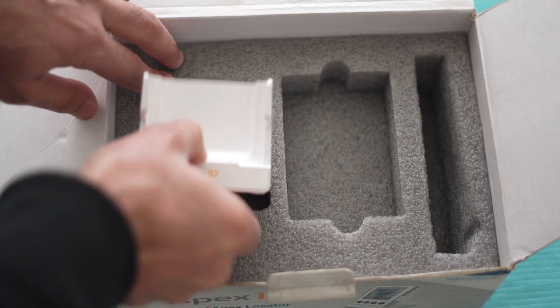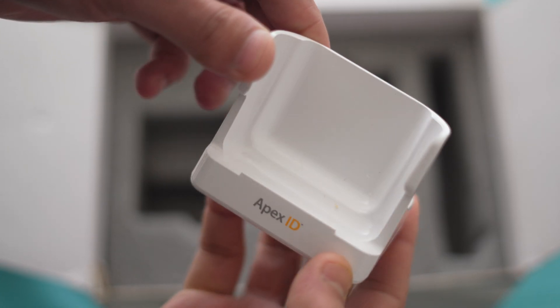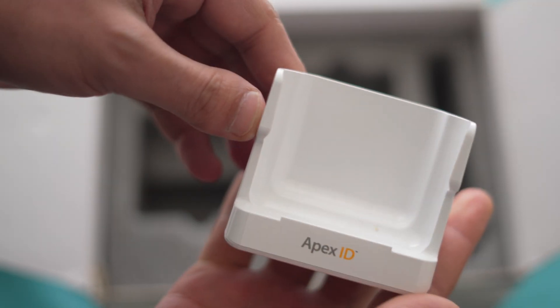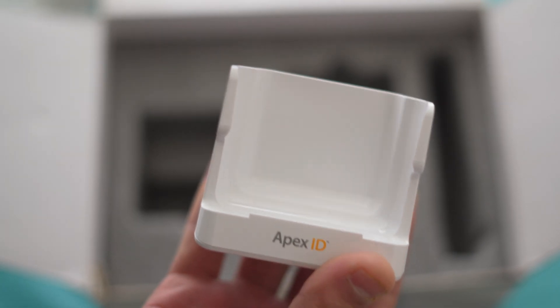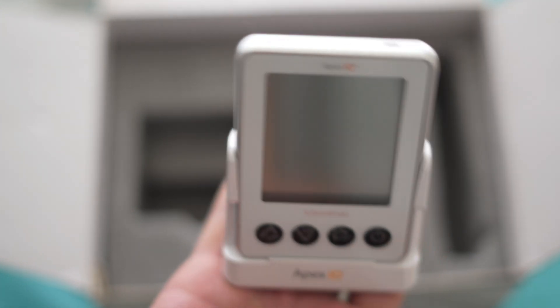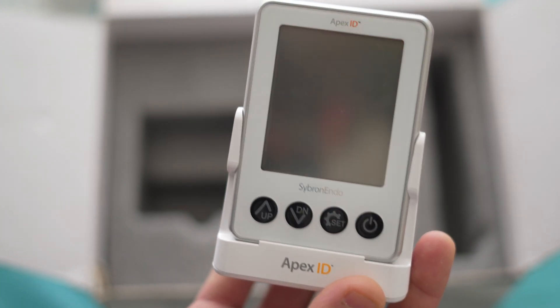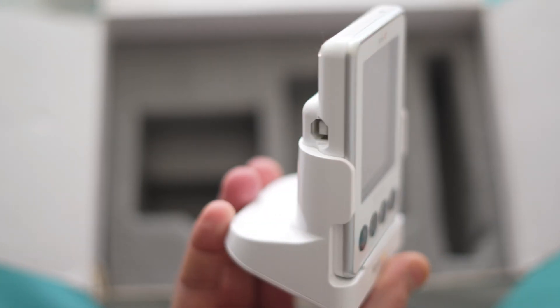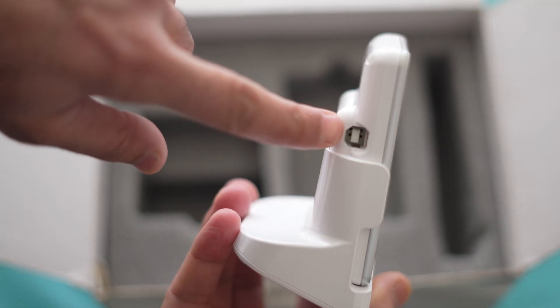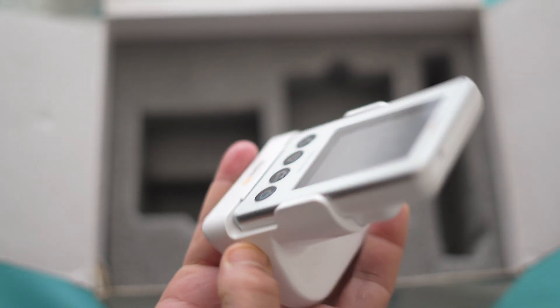The last item is this Apex locator stand, on which the Apex locator is placed so that it will be very stable wherever it is placed. This is the way I place the Apex locator — now it will be very stable on this stand and we can place it anywhere during the procedure, either on the counter or the trolley. On the side of the Apex locator is the jack where the probe cord is attached.